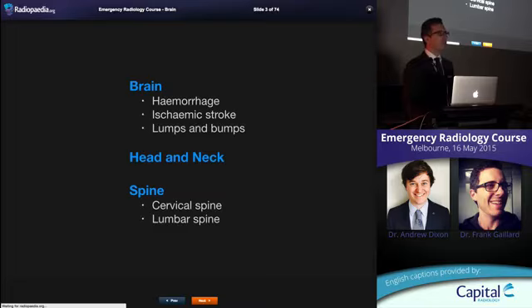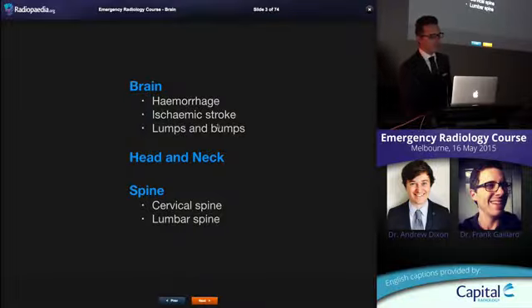Some of this is not that you're expected to know how to diagnose it on your own. There's a lot of the skill of non-radiologists using radiology is knowing when you need to ask a radiologist. But the areas that we'll be focusing on, which are really the meat and potatoes of emergency neuroimaging, are hemorrhage and ischemic stroke. And I'm going to really try and give you a foundation to understand the pathology of these so that you can interpret these extremely quickly and accurately.